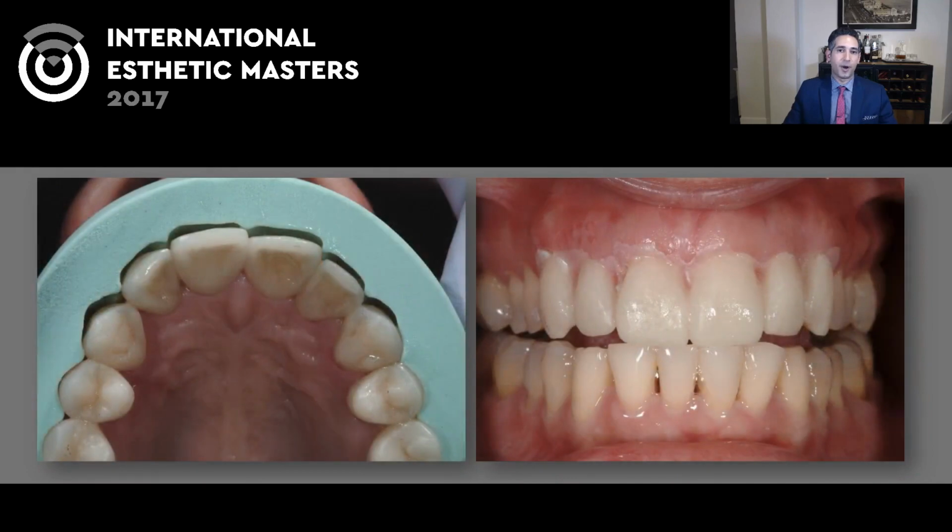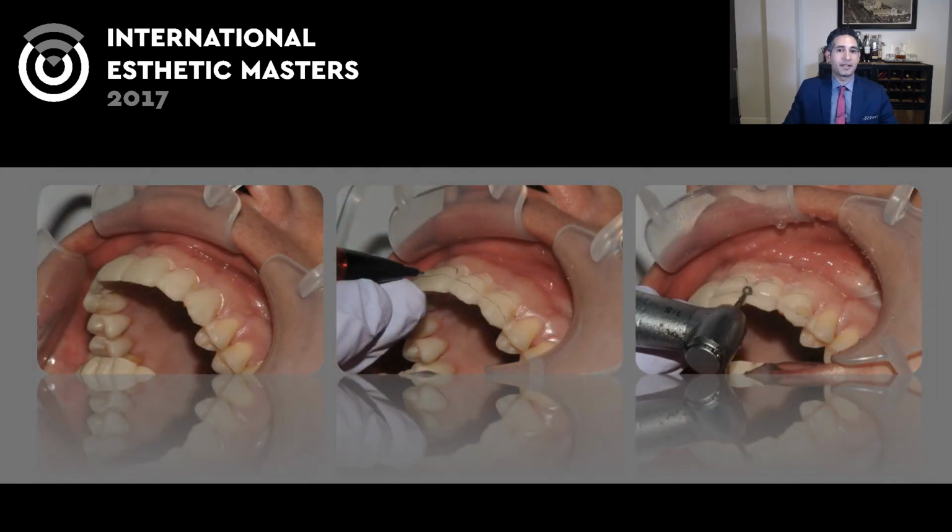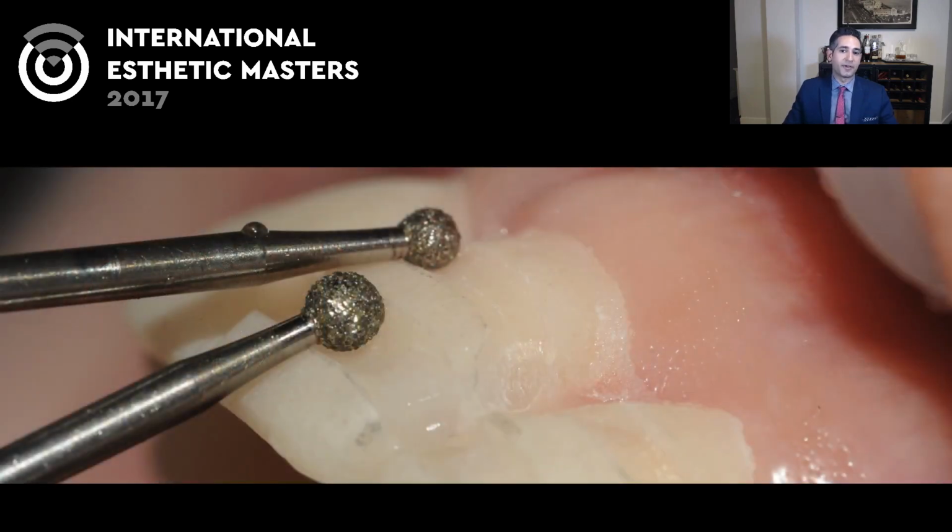So here the mock-up is going in. Let's go back to that. So the mock-up is in here on the right, and we don't have to worry about cleaning up the gingival margin or anything. We go straight to making some lines in the cervical areas in the middle third, and then using diamonds that are calibrated. So we use like a round diamond, and we can go ahead and use it to sink all the way up to the shaft area, and then we know the measurements. Like here we're making a 0.7 millimeter reduction on the middle area. We can do a 0.3 millimeter reduction in the cervical third, and we just go through prepping this way and getting a very calibrated reduction only where we need it.